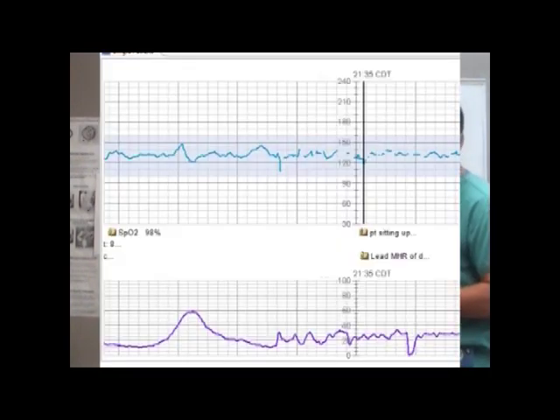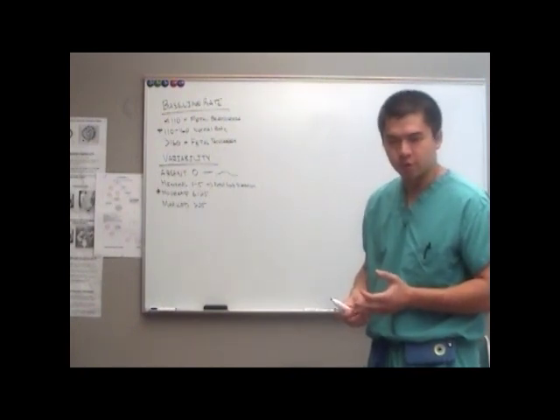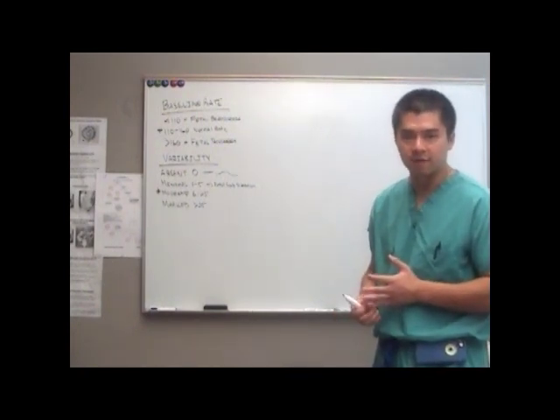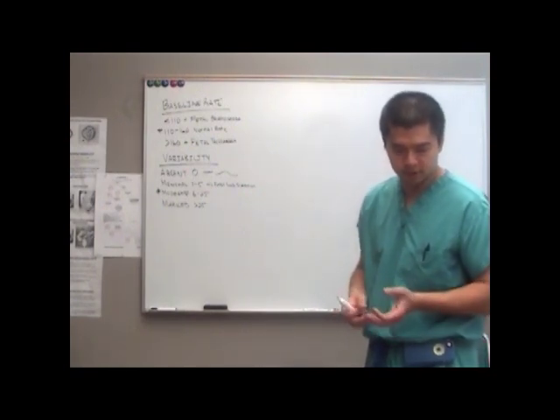What about this next example? What is the variability on this fetal heart trace? Moderate variability, because the amplitude is somewhere between half a box to 2.5 boxes. And so that's moderate variability between 6 and 25. Again, that's the only type of variability that we like.